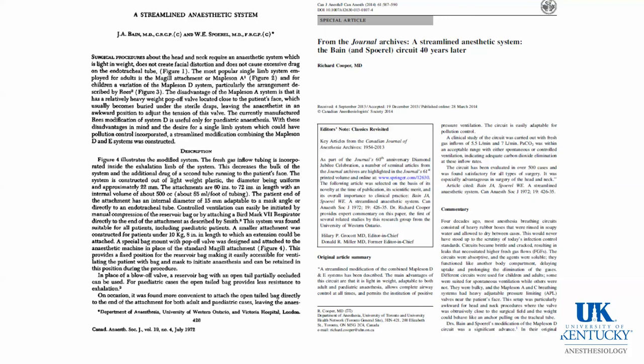You may or may not have noticed that the Bain mount can be placed on a pole, not attached to the anesthesia workstation, and in fact be used without an anesthesia workstation, such as in our safari cases. Now, Bain circuits are not available any longer at the University of Kentucky, presumably due to a lack of demand.